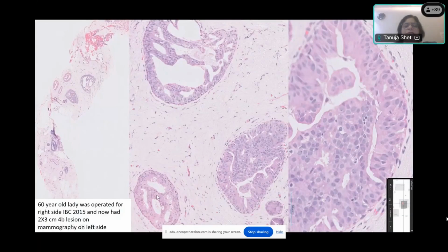You see what we call, fancy words used by older pathologists, Roman bars, trabecular bridges, all kinds of fancy terms. So you see a bridge. You see a bridge between the lumen, and the cells are oriented towards the lumen. So I know this is not usual; see this one above also, there's bridging. And when I see this orientation, then I get worried.